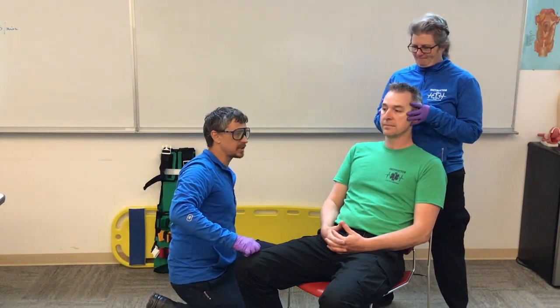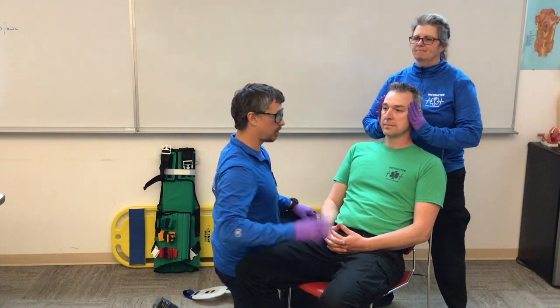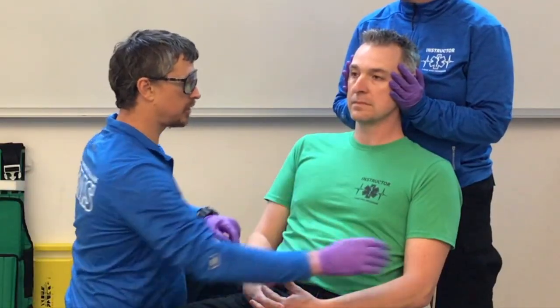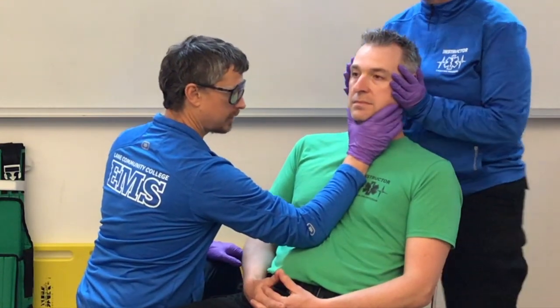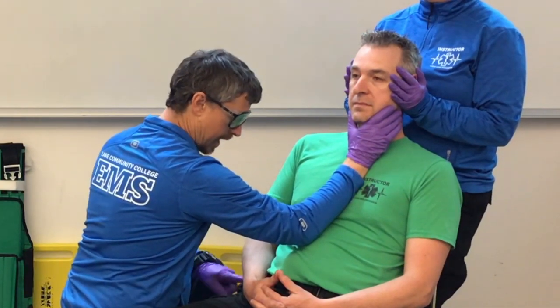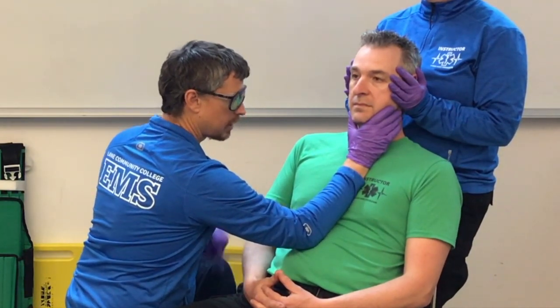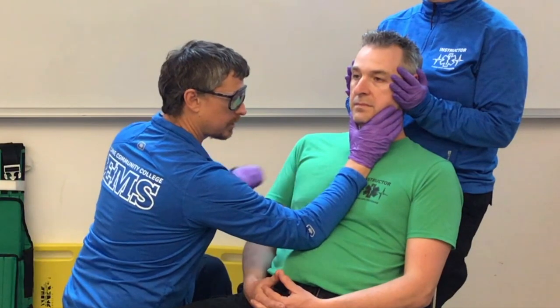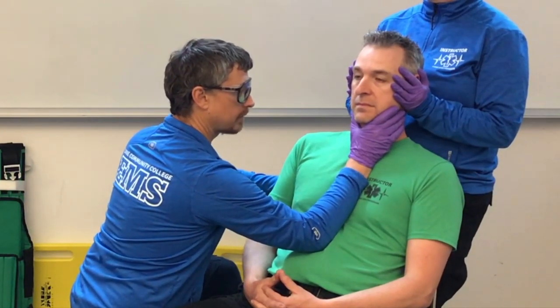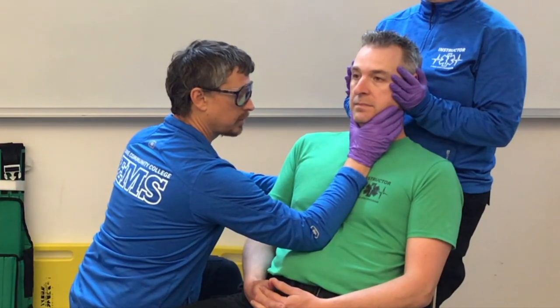Next, I'm going to have Chandler sit up nice and tall. To do that, I'm going to take my forearm, place it against his sternum, and help hold his chin. I'll tell him: when I say go, pivot at your hips, press your sternum against my forearm, and sit up nice and tall. On three — one, two, three.